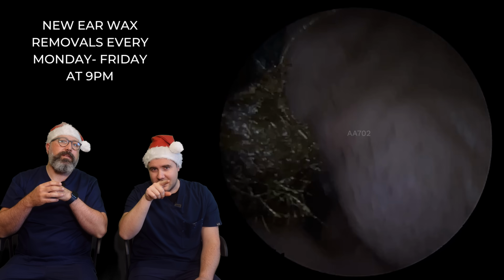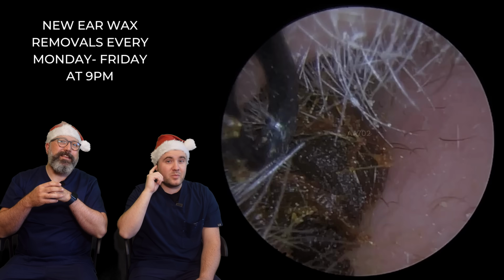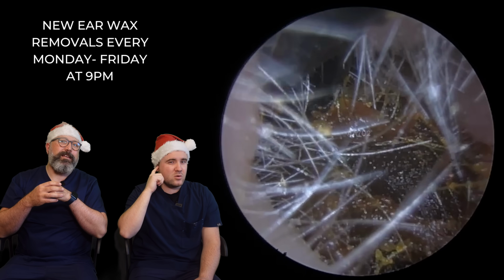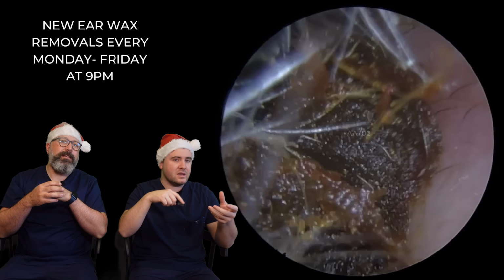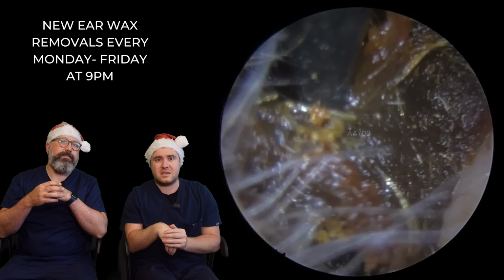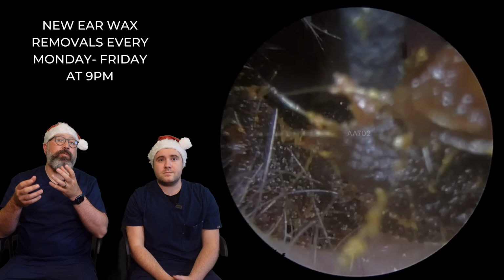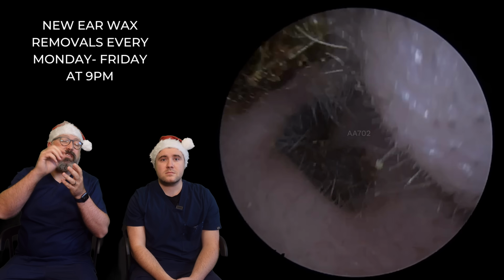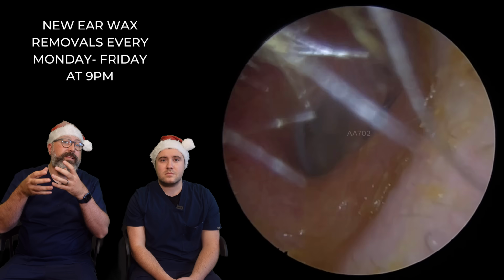And you can see those little stubby bits of hair there on the tragus, and that's where the patient does actually trim some of these outer hairs. But it's not the same kind of hair that's inside the ear canal. So that's where all this loose hair has come away and has fallen inside the ear. And you can see the earwax has done its job there, because the earwax is meant to pick up dirt and debris, but if you have anything loose, like these tiny offcuts of hair, it'll bind into that wax and bring it out of the canal.